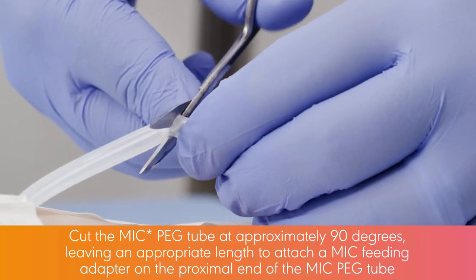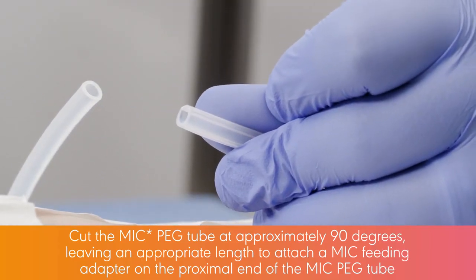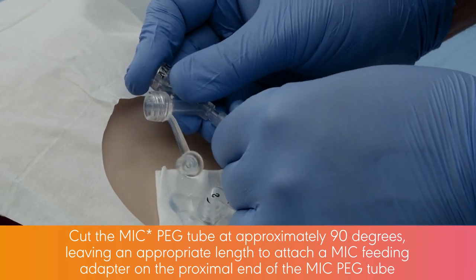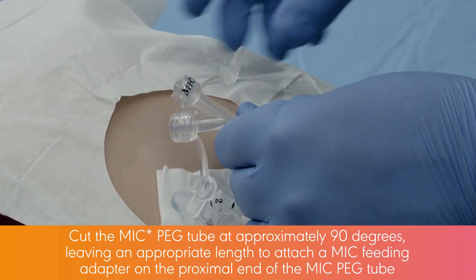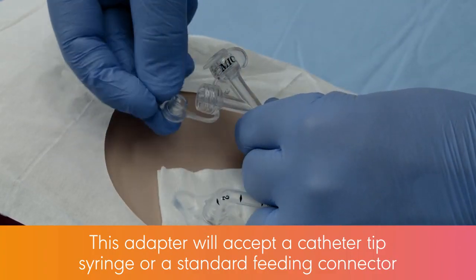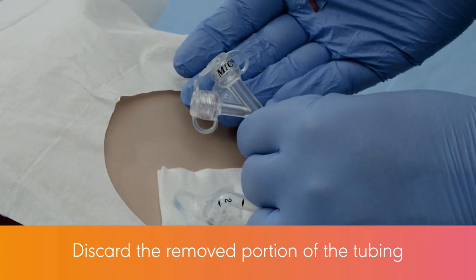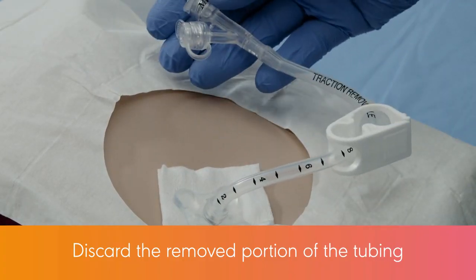Cut the MIC-PEG tube at approximately 90 degrees, leaving an appropriate length to attach a MIC feeding adapter on the proximal end of the MIC-PEG tube. This adapter will accept a catheter-tip syringe or a standard feeding connector. Discard the removed portion of the tubing.